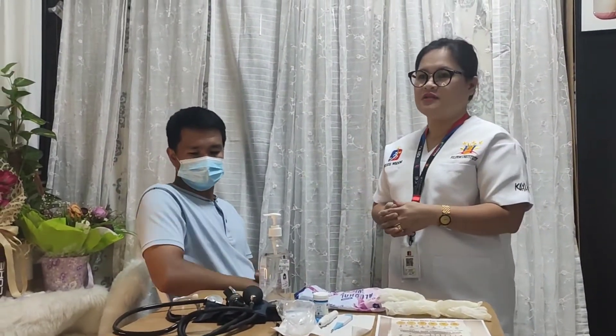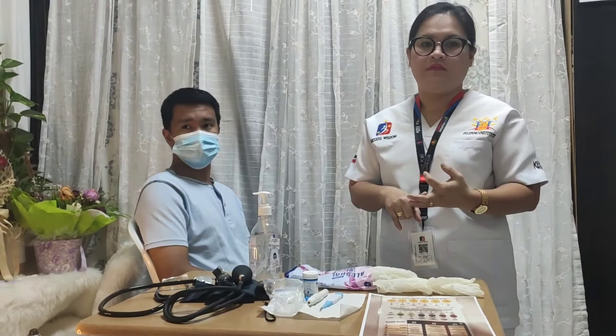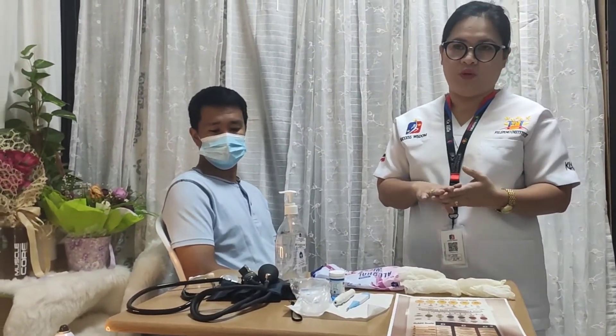Good evening. I'm going to show you the procedure on how to take vital signs. Vital signs are taken in the following indications: upon admission of the patient, as per the MEWS score of the patient, after receiving the patient from the operation procedure, during blood transfusion, and on the start of the shift routine.